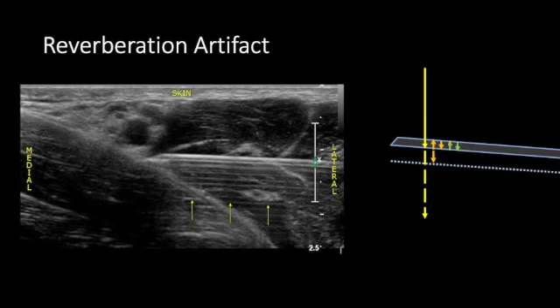And this keeps happening over and over and over again. And then an image gets generated over and over and over again at regularly spaced intervals that the machine thinks is happening deeper, but really what's happening is that there's just reflection on the inside of a hollow surface.